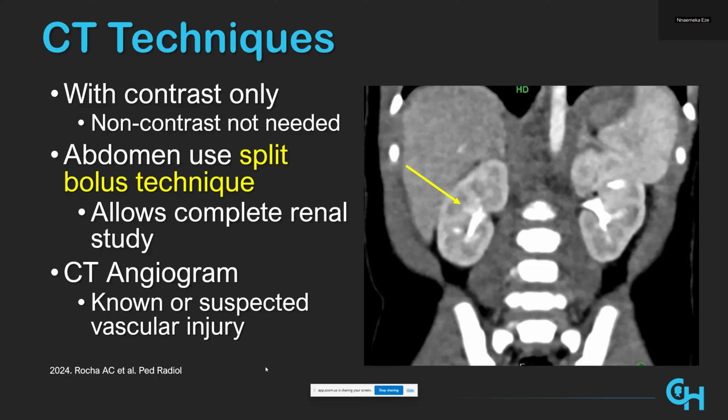I have a question. Yeah. So, there's lots of protocols and pathways, but if you had to summarize it in a quick and dirty way of who to scan, who not to scan, how can we identify those individuals if we don't have access to the protocols or know about them?